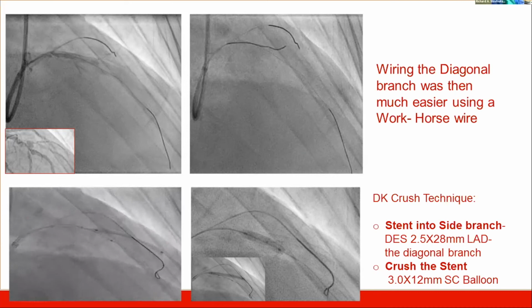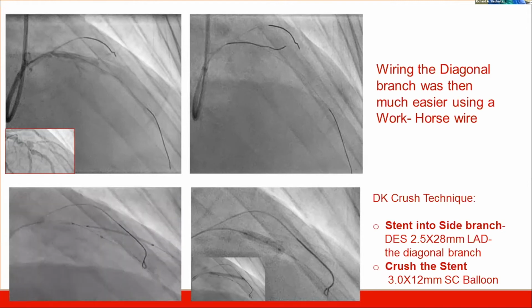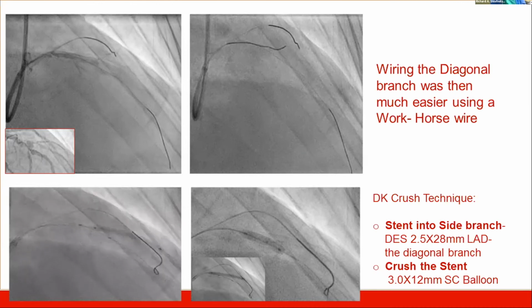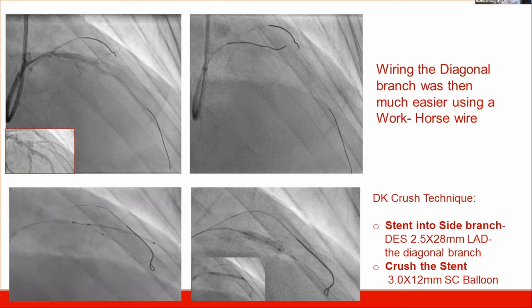And I recognize that the patient was unstable, so you had to move quickly. What I typically do is, using co-registration, I mark it exactly with OCT, so I know exactly to the millimeter where I am. But because on this film, it's hard to tell from here, at least to me, it looks like an LAD diagonal bifurcation with the way the wires are there. But you're in. I'm sure it looks great.